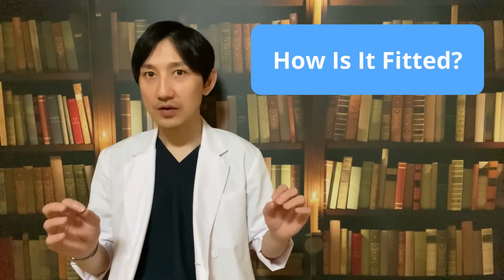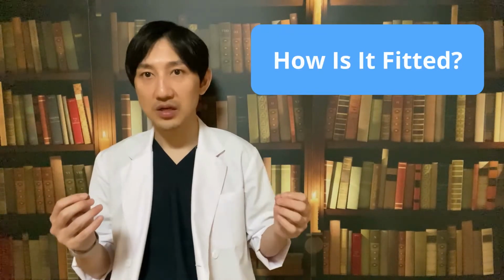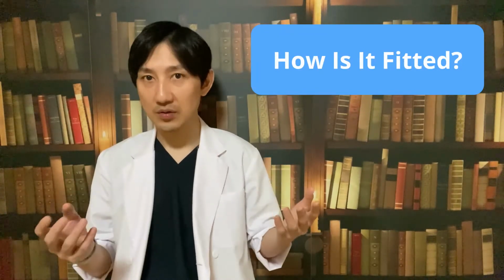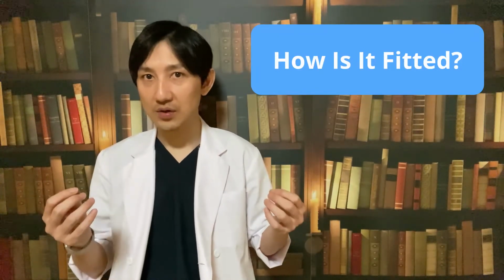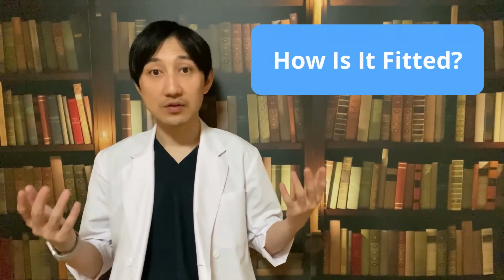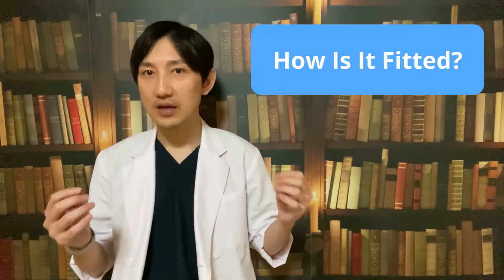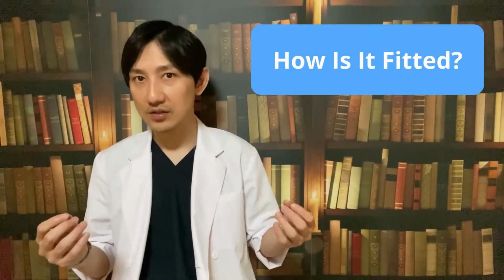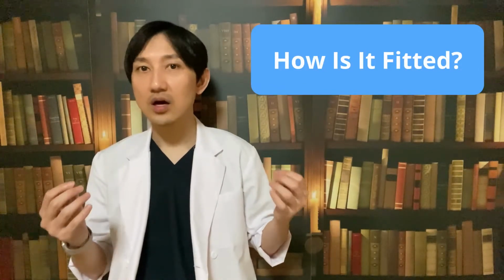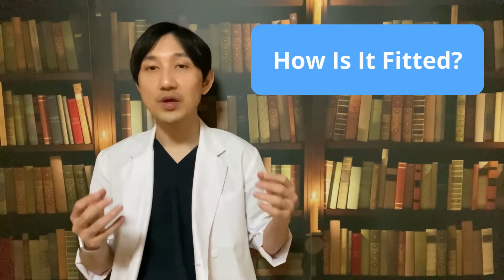Over the first few months, you should regularly check that the IUD is still in place, especially after your period. Your doctor will tell you how to do this when it is fitted. You have to feel for the little threads which hang down into your vagina. If you cannot feel them, or if they have changed position, you may not be protected against pregnancy, so remember to use additional contraception like condoms.